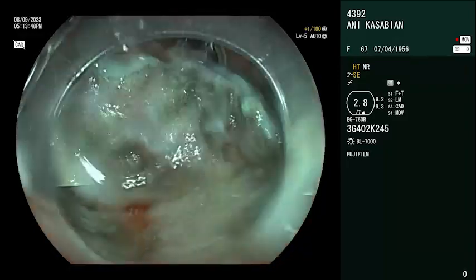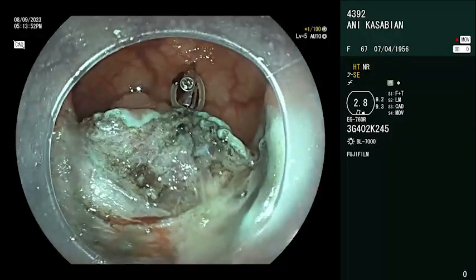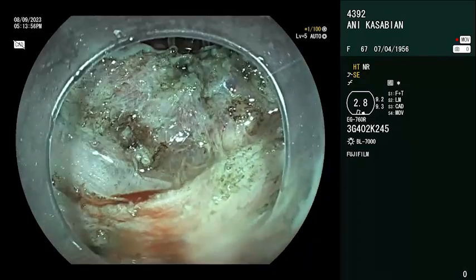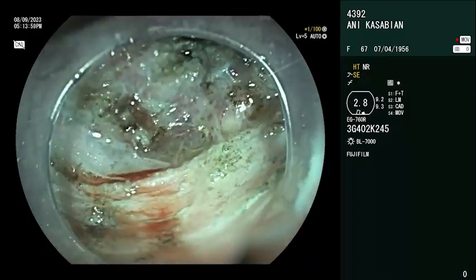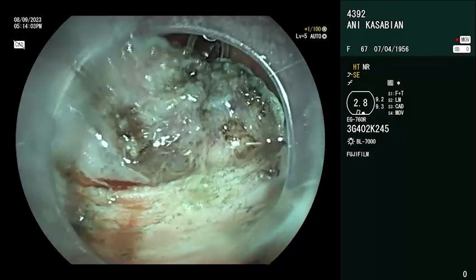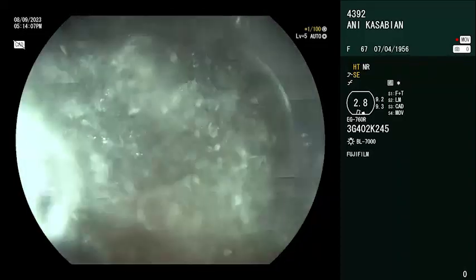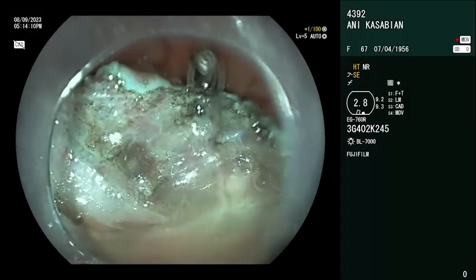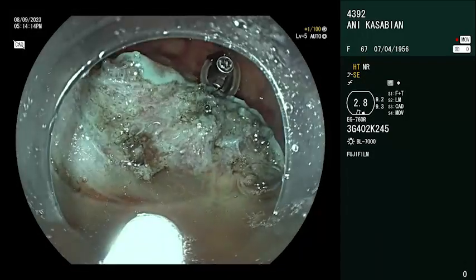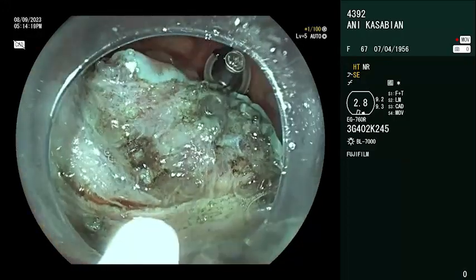But because of this kind of bleeding and some fibrosis, not so much, take your time and discuss with the anesthesiologist. You have to work with trained help endoscopists, as here. It's perfect because they are used to this kind of technique in this unit.